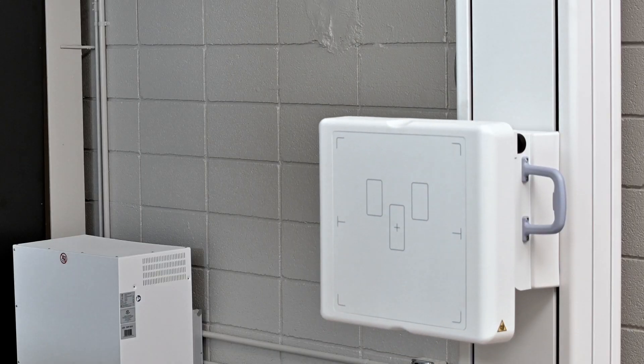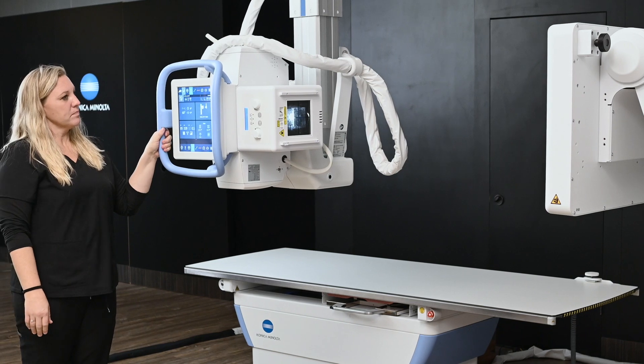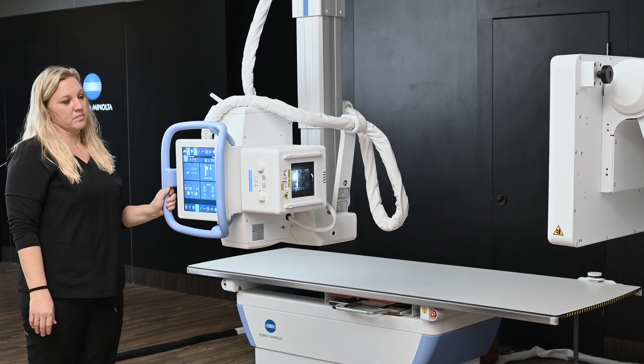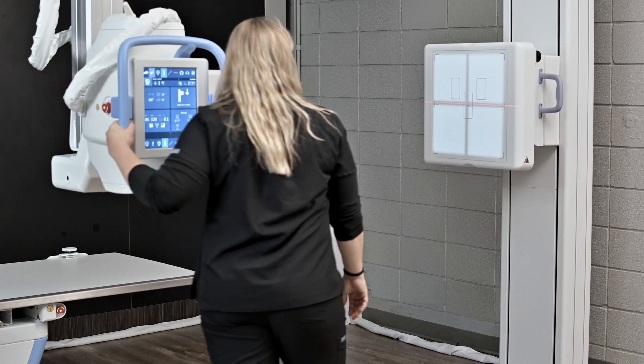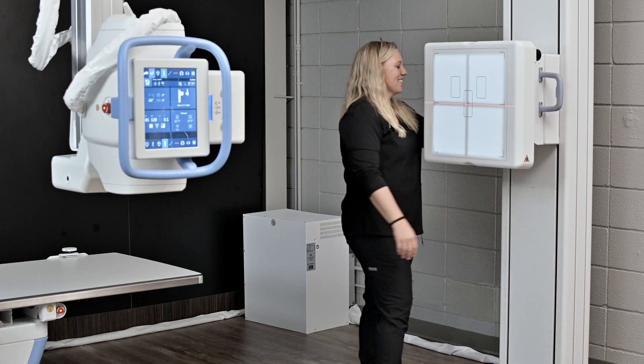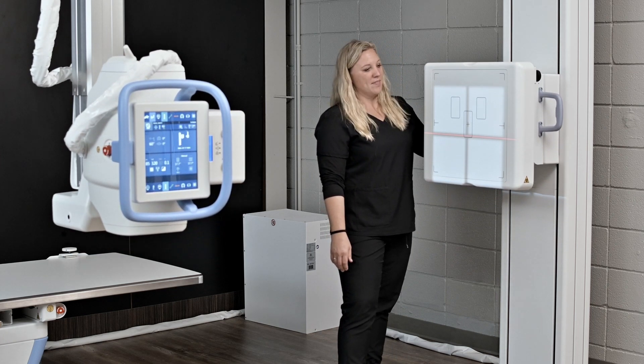In addition to the Flex unit, auto-tracking is a great asset for technologists using the room. We can auto-track from the tube head — as you can see, we are tracking from the tube head — and we can also track from the detector side as well. There's a lot of versatility with the auto-tracking capabilities.